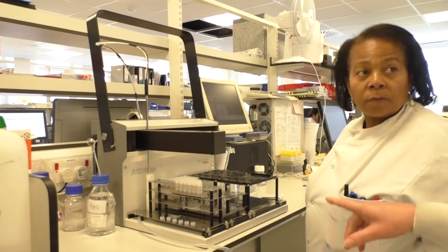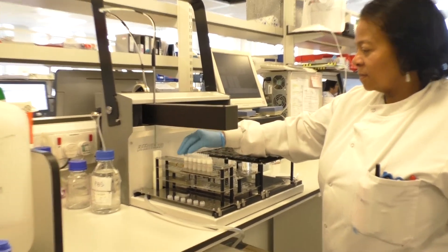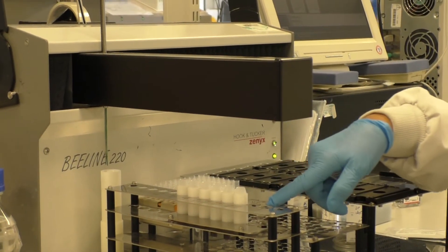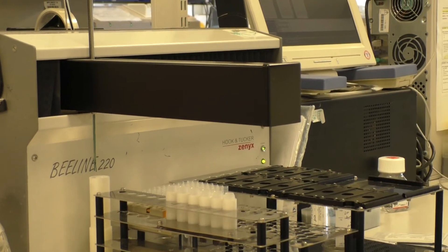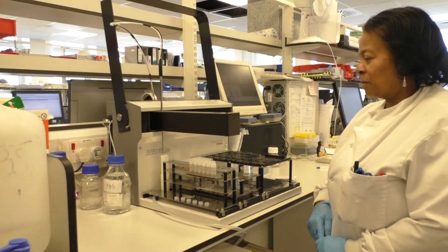There's a rack with standards and controls, which are pre-diluted. They're predetermined samples of known concentration and specificity. They're run with the patient samples on each assay.